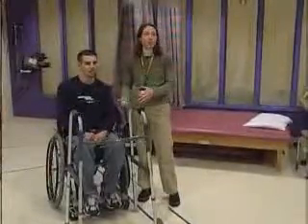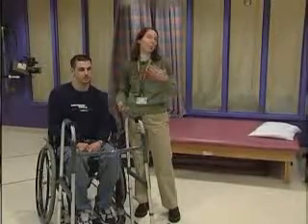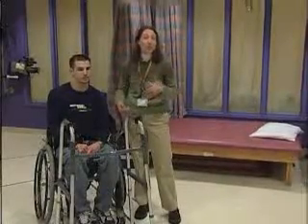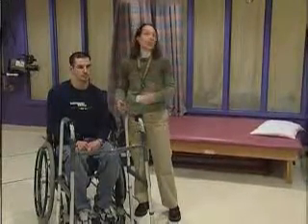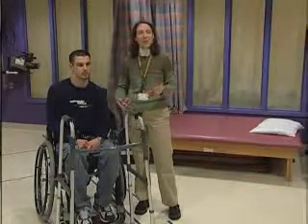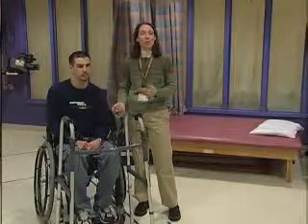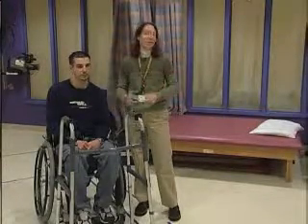I mean, he's going to use his wheelchair for a lot of things, but it gives him the ability to stand up, potentially go up and down stairs to get into other people's homes, walk onto an airplane. So it can really help with just those little functional activities that none of us think of for somebody in a wheelchair, how difficult some of those may be. So we may be able to impact some of those.